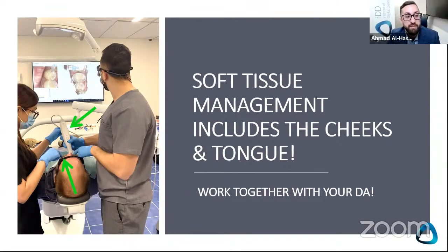I'm retracting with my other hand. I'm scanning with one hand. I'm looking at the screen. You don't need a gigantic TV to scan, guys. Don't worry. Look at the laptop. The other key thing you can see what she's doing with her left hand is holding the wire. This is a little quality of life improvement I like.